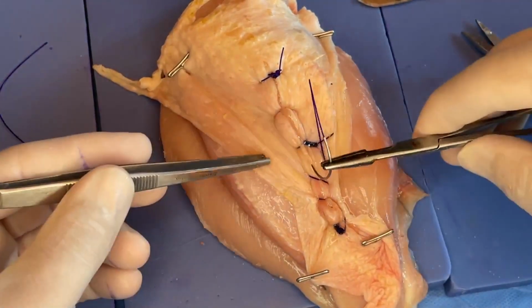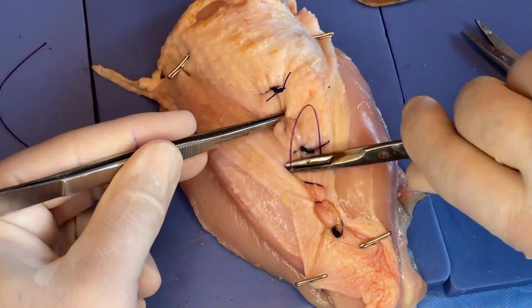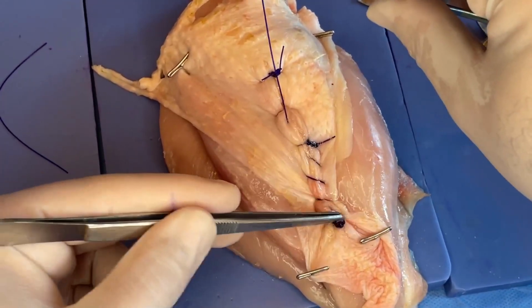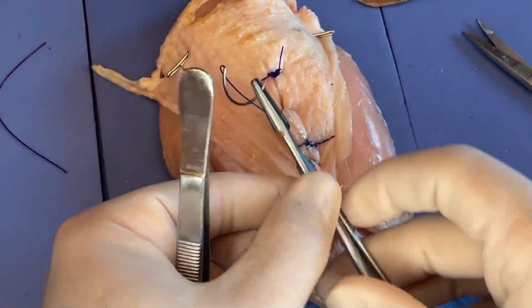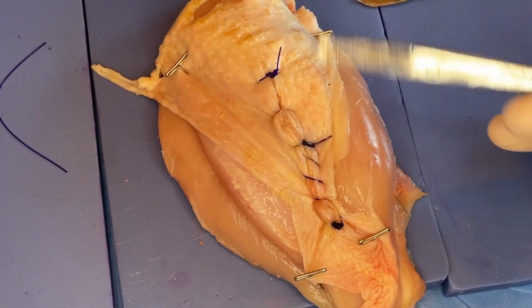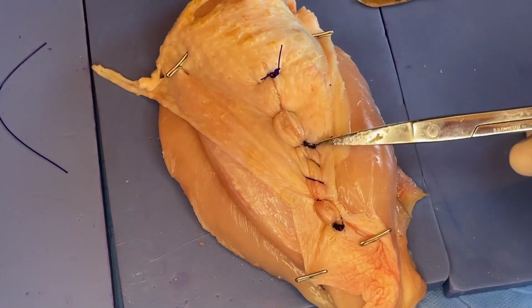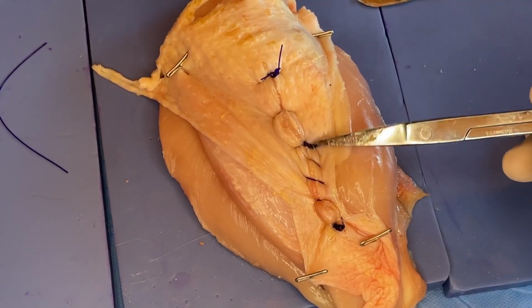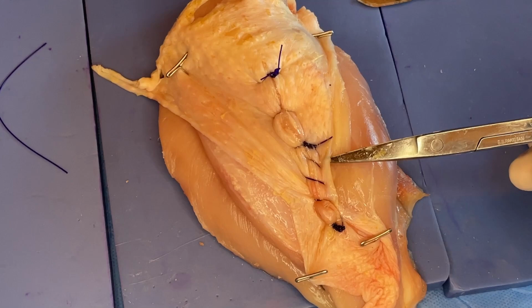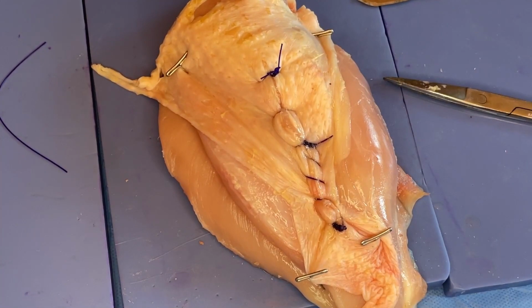Occasionally, I'll even do two like this and kind of come over to the other side, do a little bit of a backhand. I typically don't do this. It's just something that you can do to try to bury this knot so it's not quite so prominent, and then you just cut this kind of flush with the tissue. So compared to this interrupted where the knot's really sticking up above, where we buried the knot completely invisible, here with our running, this first one got tucked down, so at least kind of on the tissue, and then this one here really sticking up, but with trying to bury it, pull it under, it's a little bit better. So that's PDS.